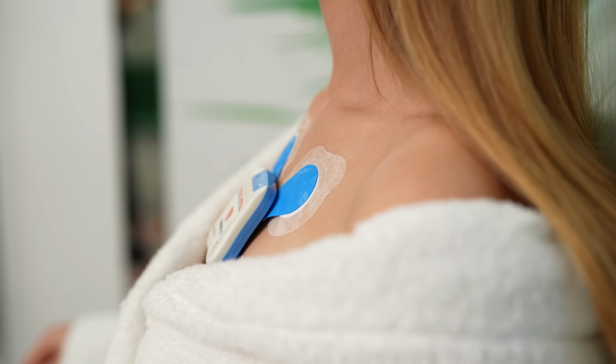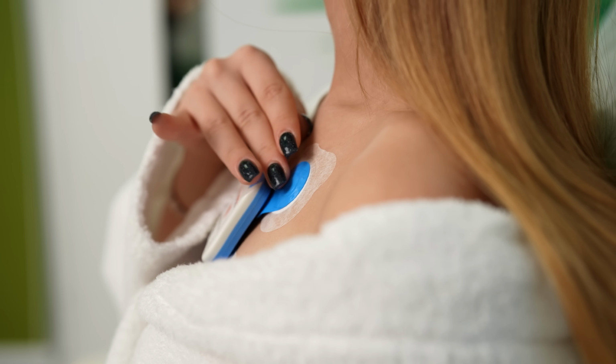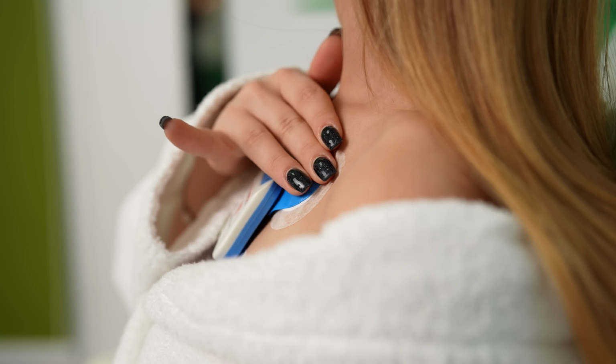However, if a patient says, you know what, I get this infrequently, we have a monitor for 2 weeks. There are some monitors that patients can wear for a month. They're not wires though. We're really moving to an era where you can just put a small patch, and so you stick a patch onto the chest. It's much easier for the patient to wear, and we can record all that data over the course of 2 weeks or even a month.